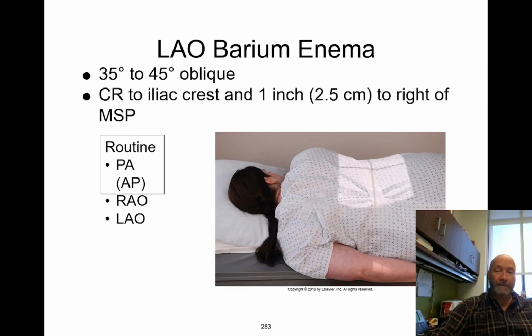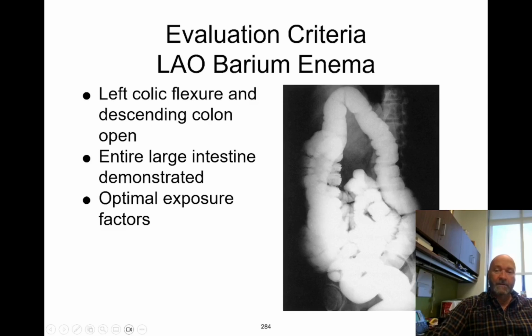So just basic positioning. Sometimes also keep in mind that all your patients are not going to be the same, and your colon, in this case, what we've got is a very vertical transverse colon. This thing is just kind of a mess. Positioning wise, and as far as image integrity goes, this is a good image because we see the open flexure. And it's a solid column image as well, but we see the open flexure. And since we see the open flexure, then it's a good image.